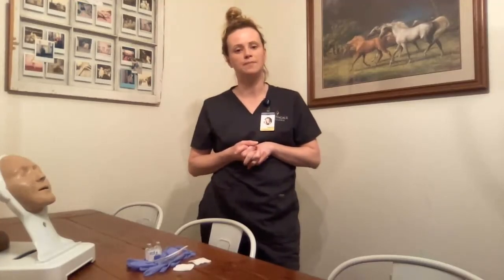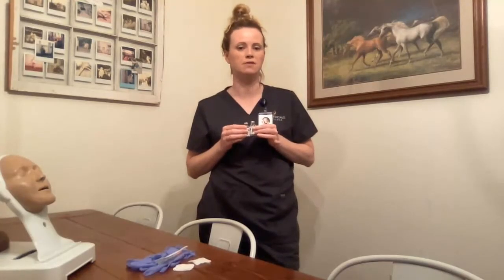The medication order for my patient is insulin. The order states: give four units of regular insulin and eight units of NPH intermediate insulin. So I will be combining the two medications into one injection, equaling out 12 units of insulin subcutaneously for my patient.